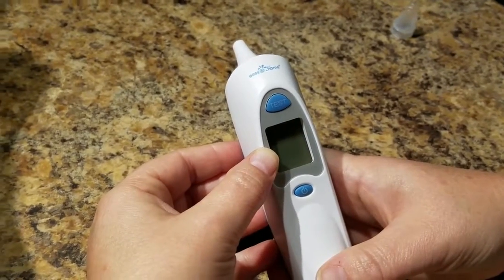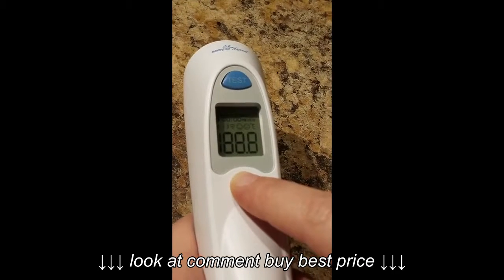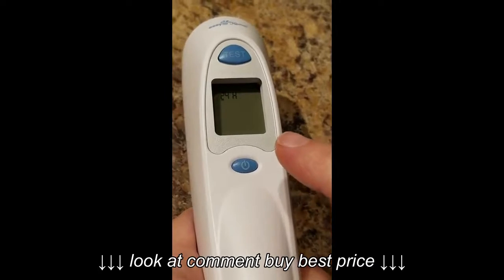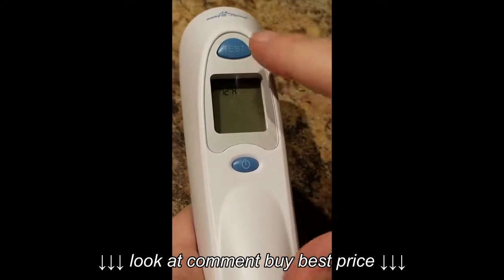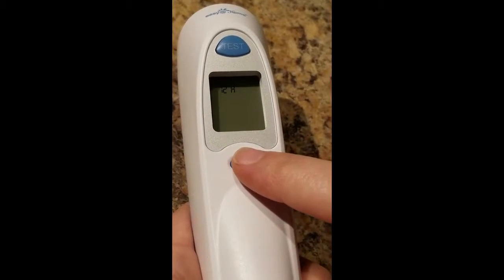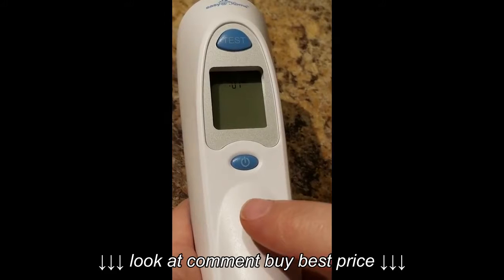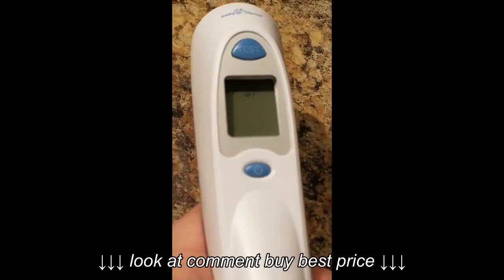digital ear thermometer. Alright, this is how you set the time on the thermometer. Just hold down the power button for 3 seconds. It'll pop up and say 24 hours at the top. You can change it to 24-hour format or 12-hour format. I prefer the 12-hour. So once you've got your selection, hit the power button again, and it's going to bring up the time. And the time is now 11:30.